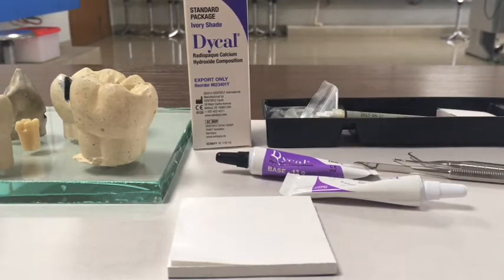Hello students, in this video we are going to teach you how to mix calcium hydroxide cement. Calcium hydroxide cement is one of the most commonly used cements in dentistry. It has a cariostatic property and produces an alkaline environment which makes it difficult for bacteria to propagate in the cavity. So let's get started.